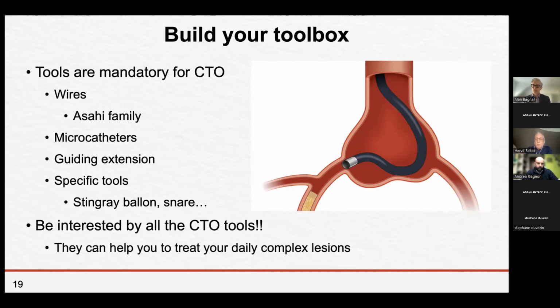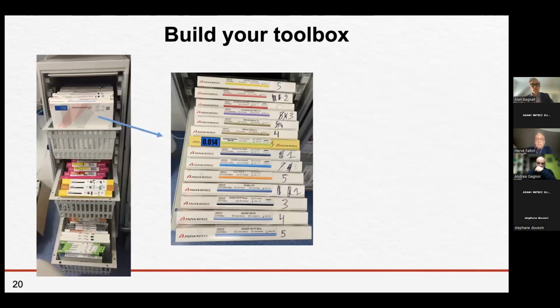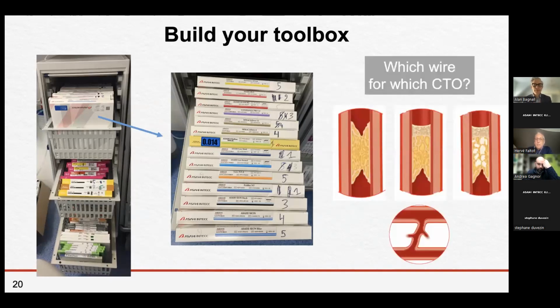And when you become interested in all the CTO tools, they are going to help you in your daily complex lesions. So guiding catheter, microcatheter, anchoring if necessary, etc. This is my toolbox, and in my box, you see all the Asahi wires. And the question is, which wire for which CTO? And when you can answer this question, you will master the situation.